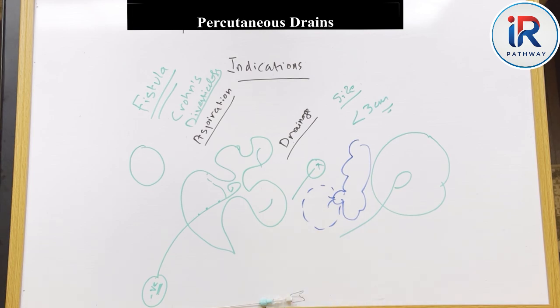And as long as a fistula is present, it will never heal. The opening will remain. So if you only aspirate, the collection will refill within a day or two. So what is the management? If surgery is not safe due to active inflammation, we can place a drain for continuous and immediate drainage. This continuous drainage gives a better chance for the fistula to close and heal on its own.